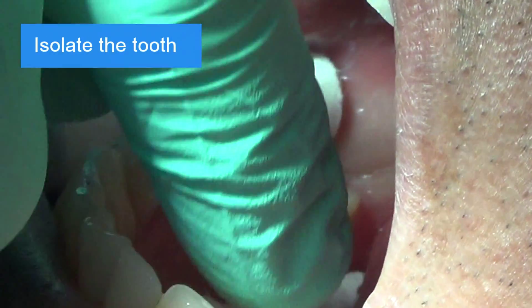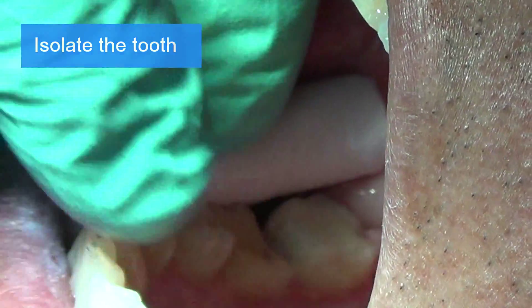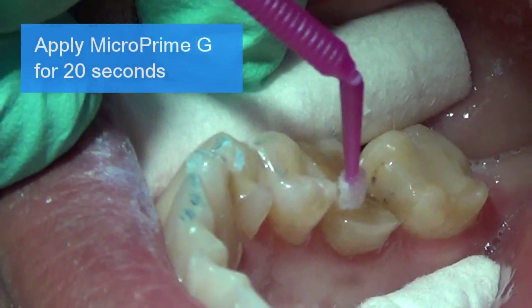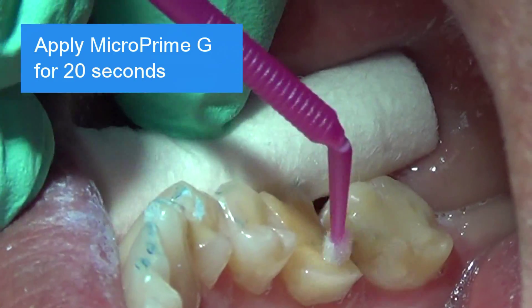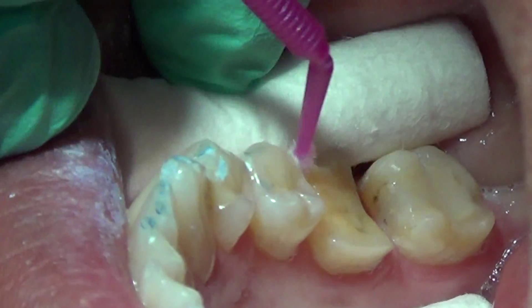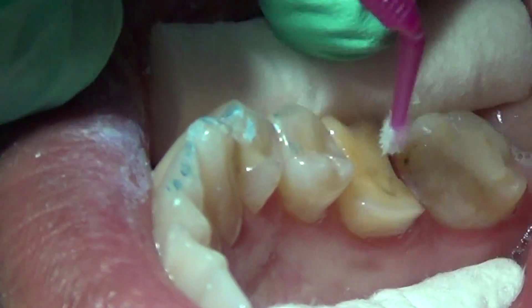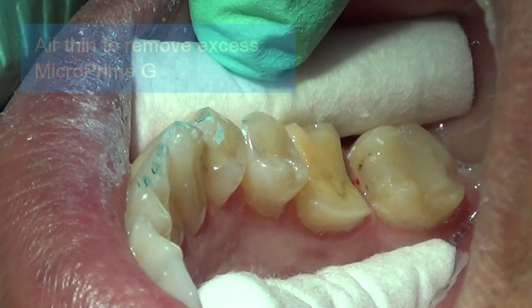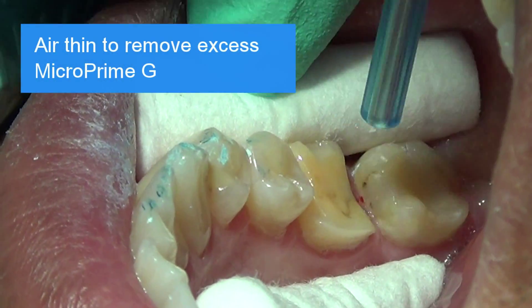Isolate the tooth. Apply MicroPrime G thoroughly and liberally for 20 seconds. Air thin to remove the excess MicroPrime G.